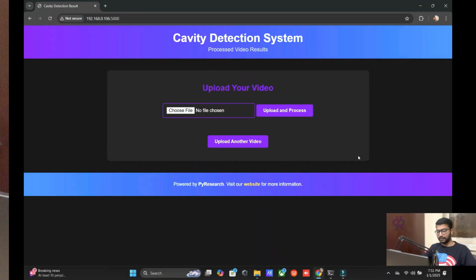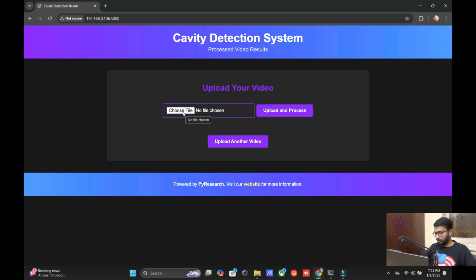In this video, we are going to explore something new. Our topic is a cavity detection system. It's a very simple process. You can see the result within seconds, and you will be analyzing it yourself. You record your video and upload it.